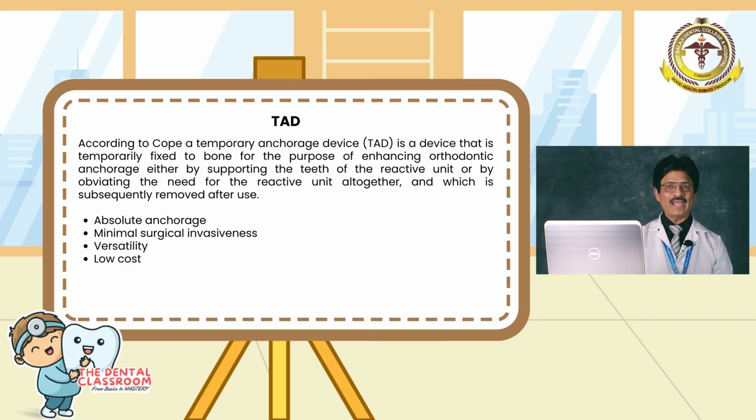What we mean by a TAD is a temporary anchorage device, and according to Cope, it is a device that is temporarily fixed to bone for the purpose of enhancing orthodontic anchorage, either by supporting the teeth of the reactive unit or by obviating the need for the reactive unit altogether, and which is subsequently removed after use.